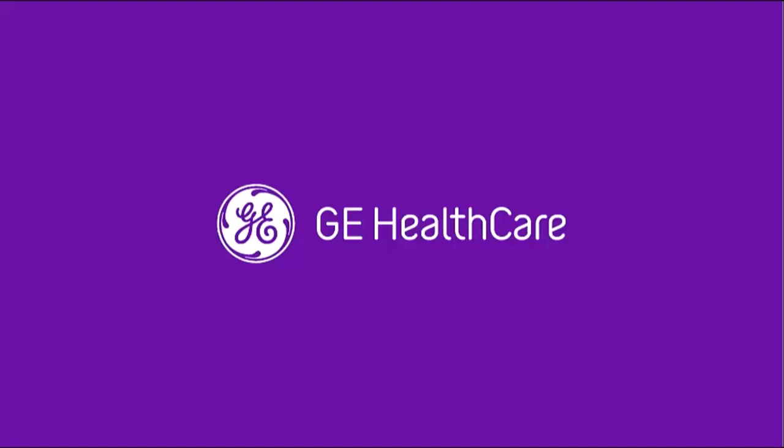I think I will finish with this one because it's quite an important one. Fat water pixel swap artifacts: can you tell us again the steps taken to avoid the artifacts? This isn't going to magically work 100% of the time. It is very challenging, because Dixon works amazingly when it works, and when it doesn't, there's not a lot that we can do and control, especially beforehand. But the main thing is to ensure you don't have any wrap in your image, so either increase your field of view or apply no phase wrap, just to ensure you don't have that.